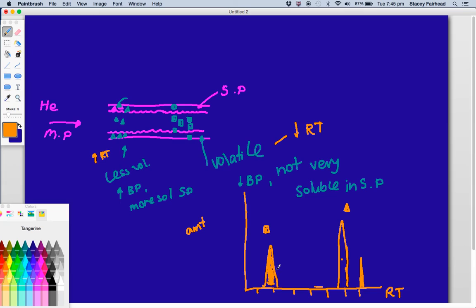It is possible, so let's say that this was a known standard of two substances, could be, say, something like a particular drug or alcohol. So if what's shown in orange is a known standard with a known retention time, then it's possible to run an unknown through that, and should an unknown peak come up, then you know that this substance here is also present in your patient's blood, let's say, or urine or something like that.